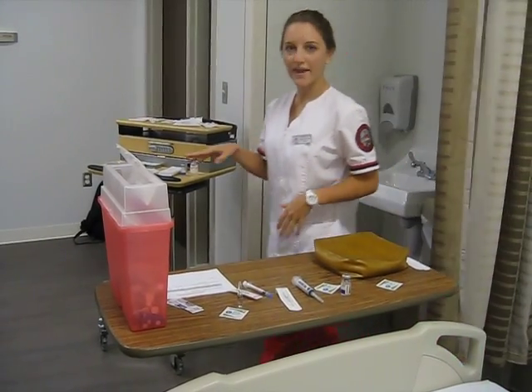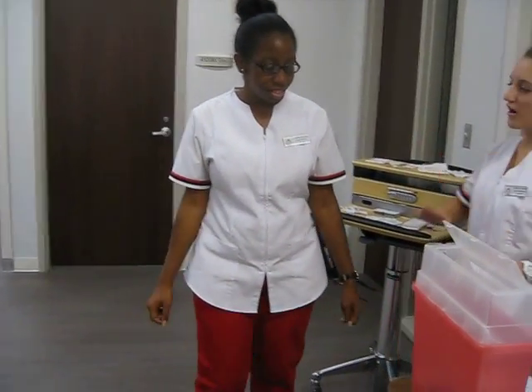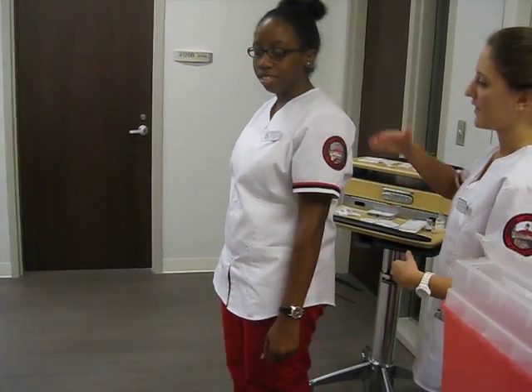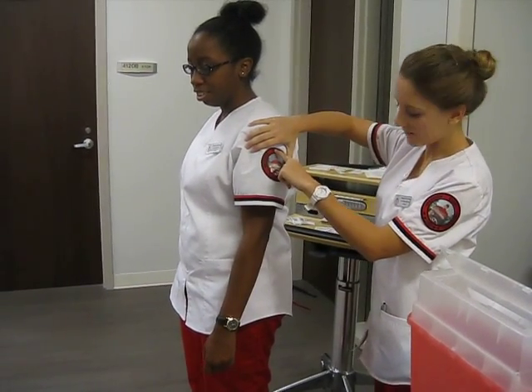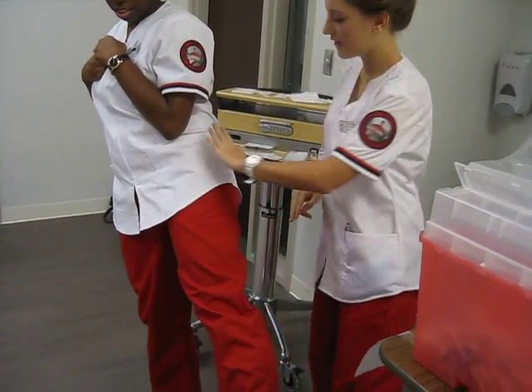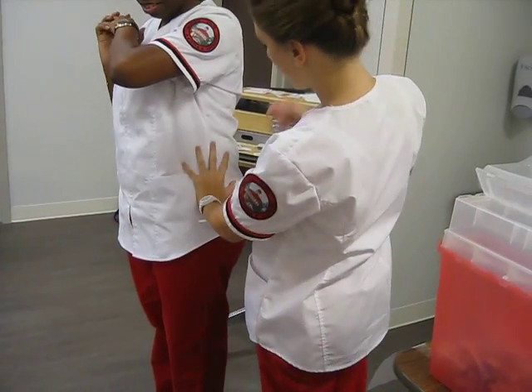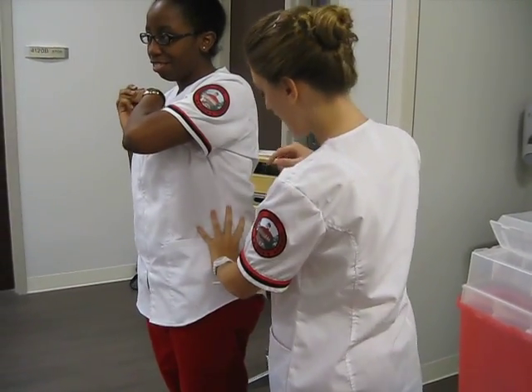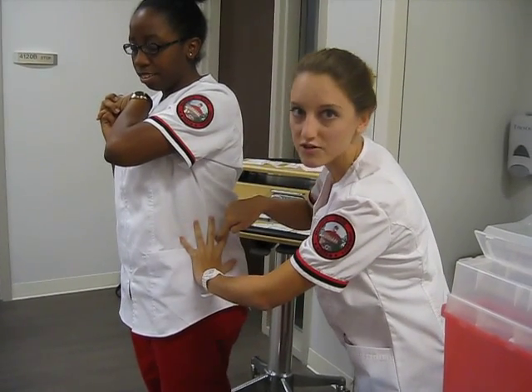I will have my model come in to show my injection sites. For our intramuscular injection sites, we have the deltoid — we will find the acromion process and go down, and this would be our injection site. Now can I have you lift your leg to the side? We're finding the greater trochanter. Make sure to feel for the iliac crest because you do not want to hit that bone, and then I would insert my needle here. This is for ventral gluteal.